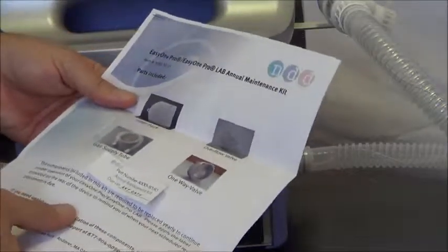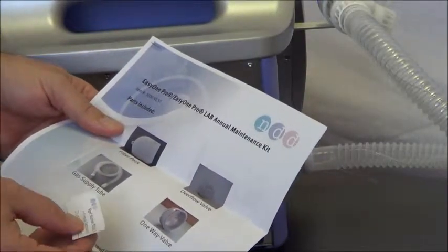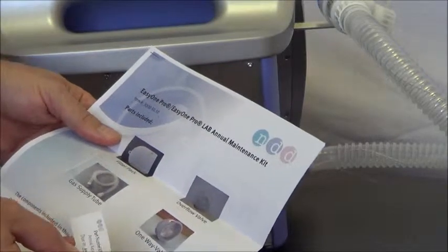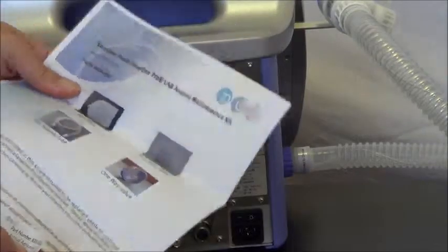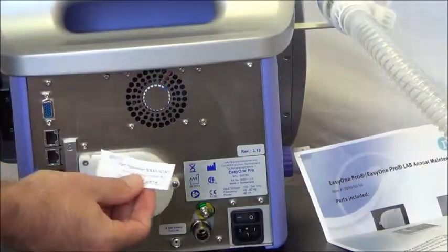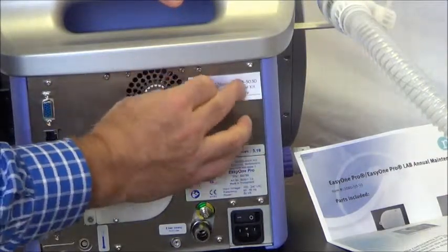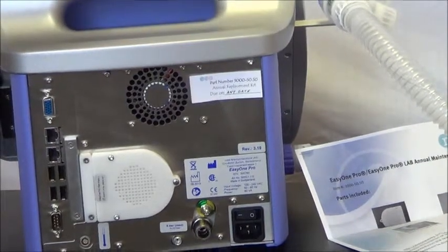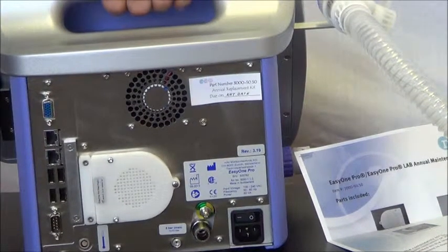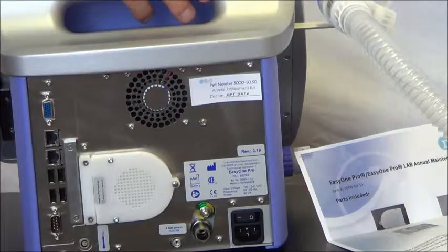We've provided a label on the instruction sheet that we'd like you to adhere to the device. We've put a date on there — a year out from when you purchased the kit — and we recommend you put that label right here on the device when you're done replacing the parts. This will remind you a year from now that you need to do a similar operation. We also recommend that when you're done, you do a test DLCO on yourself to make sure all the parts came together correctly and that your device is ready to go.